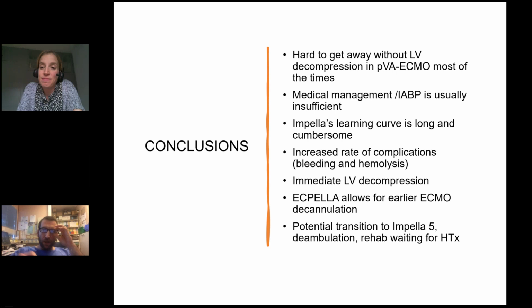Okay, maybe one last question on that topic, because some of us may be thinking about going into this technique without having used PA catheters lately on a regular basis. Did some of the clinical studies that you showed to us include centers that did not on a regular basis do either invasive pressure measurements in terms of PA catheter or even measurements in the lab?